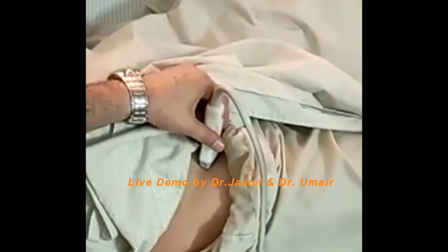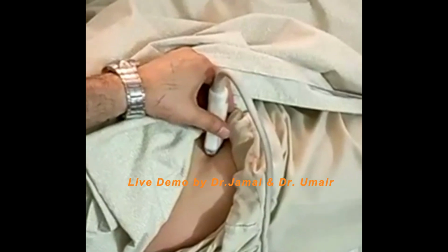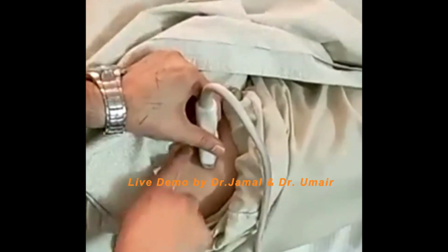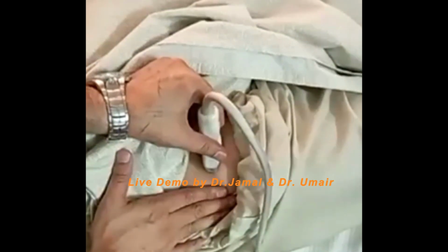Once the femoral artery, femoral vein, and femoral nerve are identified, and the probe is moved laterally, we are going to see the sartorius muscle and the tensor fascia lata on the ultrasound machine.